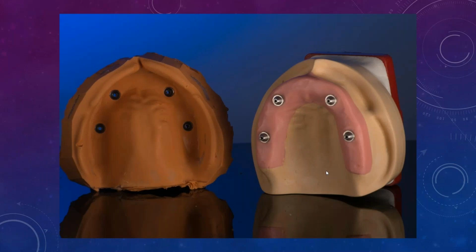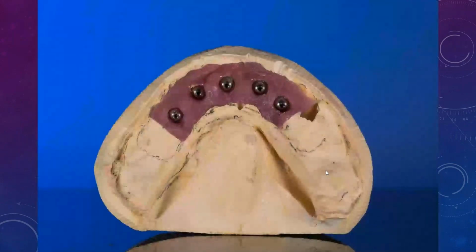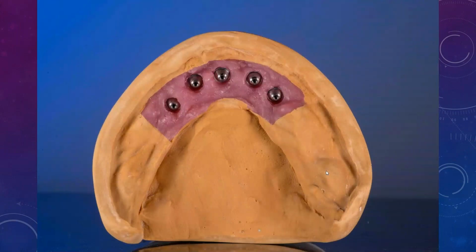Let's say, for example, you took your impression with luted jigs and you got your final model. And make sure you do your models properly, guys. This particular case was done by one of the big box labs, and you can see that it's just all over the place. You got huge voids in the models. The type of stone used wasn't die stone, so it was a high expansion stone, so it wasn't passive and everything else. And this is the model that I did after that case. We already did the whole thing, so way different.